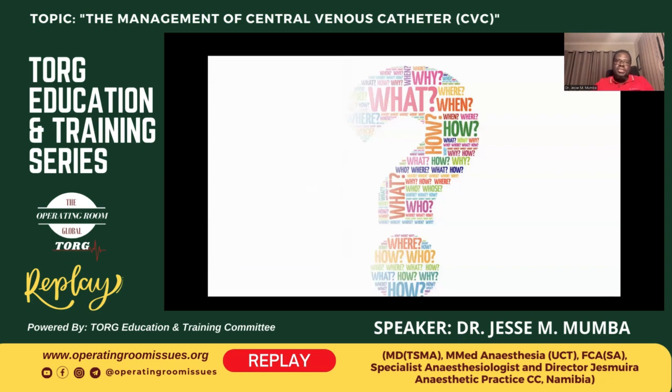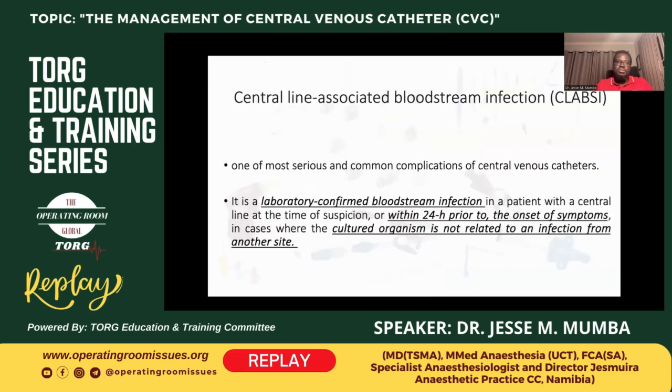So we've seen why we need the central line and when we need it, who should put it, and how it should be done. But from here, the next part of the talk will be to define one of the biggest complications, which is the central line associated bloodstream infection. And then we'll look further into how we are going to avoid this.